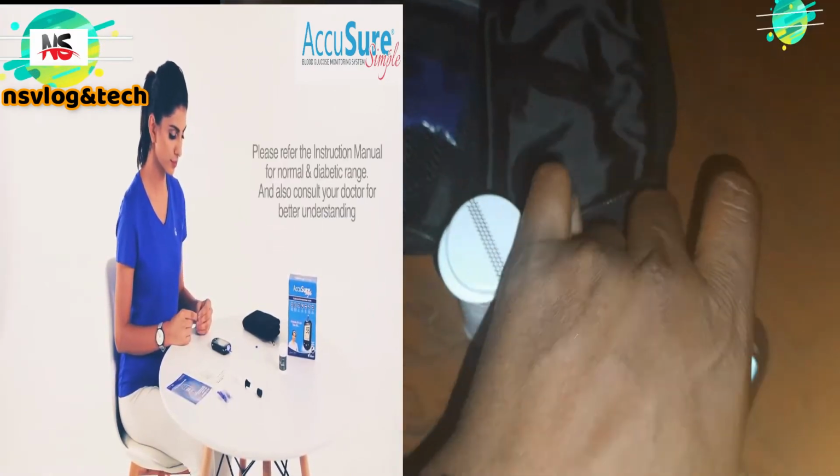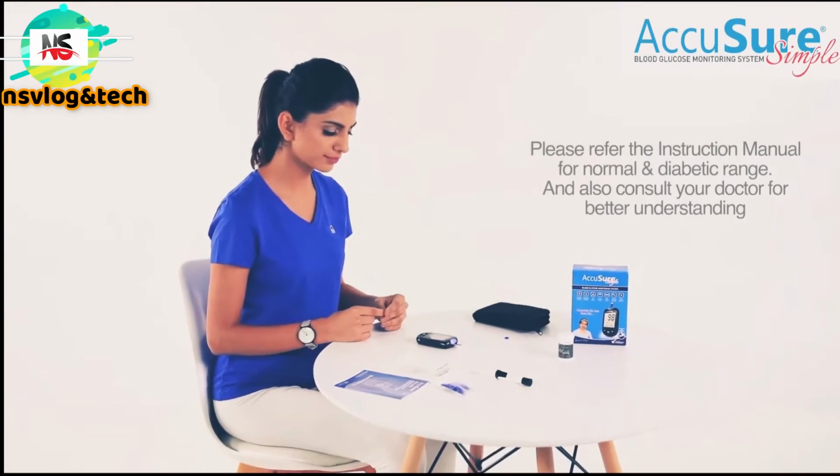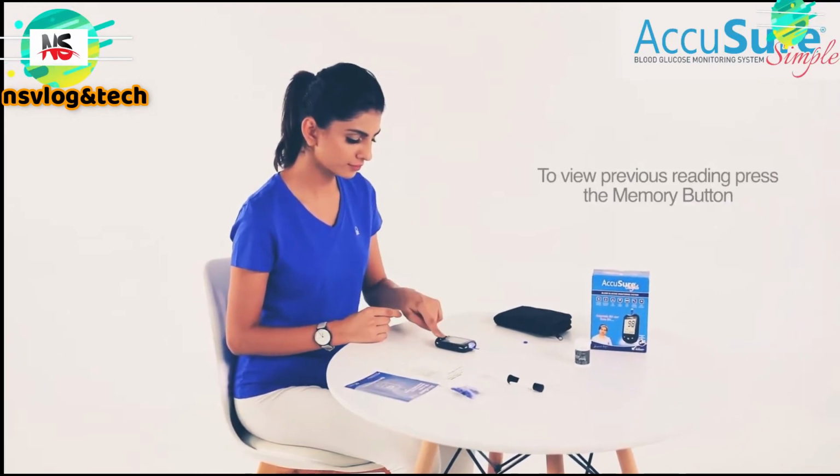Please refer the instruction manual for normal and diabetic range, and also consult your doctor for better understanding. To view previous reading, press the memory button.